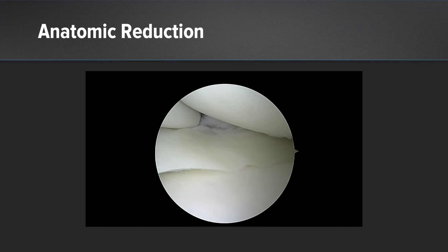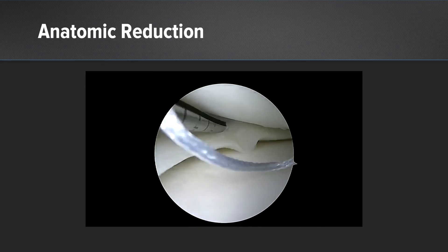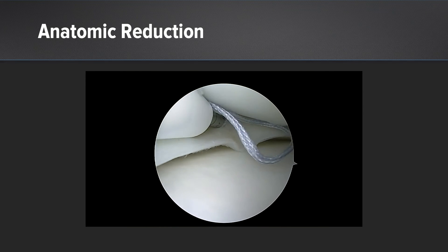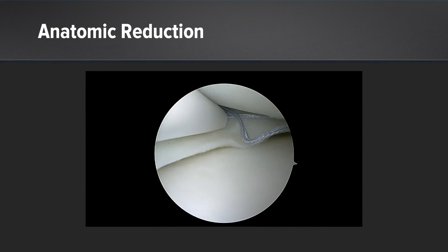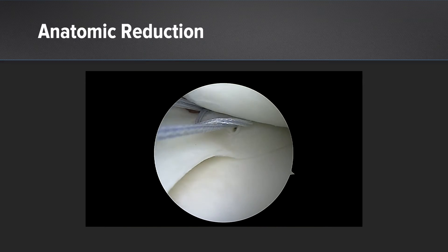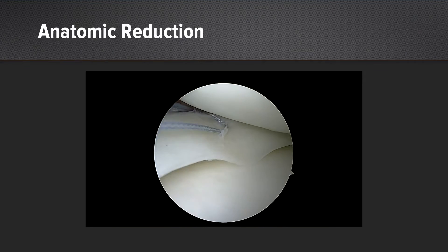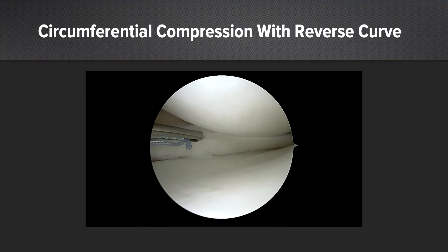Your first stitch is your absolute most important stitch — you must obtain an anatomic reduction. I go where I can see the tear the easiest, and that for me is in this location. This is a vertical longitudinal tear, so we're going to use a vertical mattress configuration with just one perforation of the meniscus. Here we really get a nice tensioning and an anatomic reduction, then from there we move more centrally.